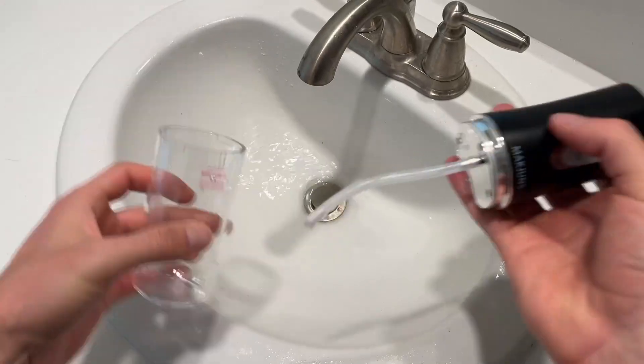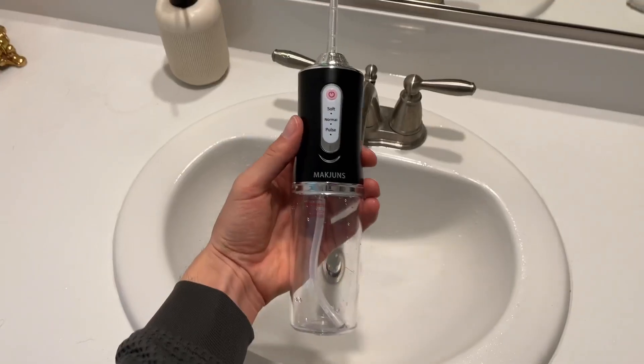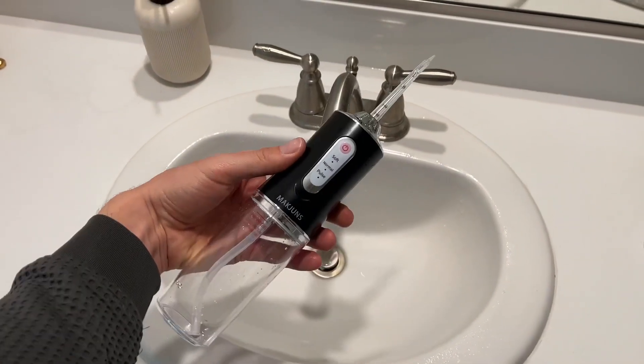When you're done you can pour out the water. This is extremely easy to store and travel with. Overall, we were very pleased.